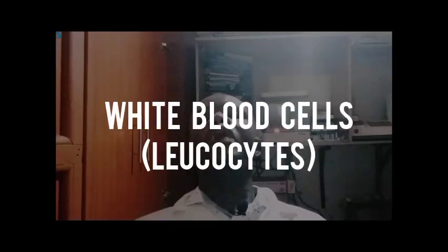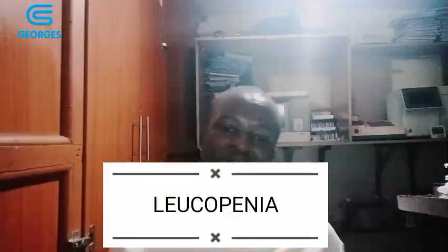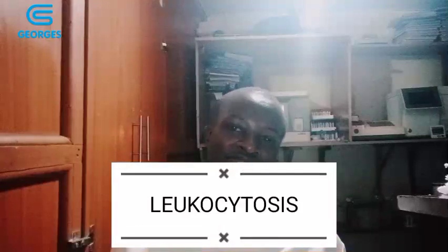Right now we want to do something on white blood cells. A decrease in the number of white blood cells is called leukopenia, while an increase is called leukocytosis. So when there is a low number of WBCs, we will say that is leukopenia. When it is increased, we will say that it is leukocytosis. The reference range is 3.5 to 10. WBCs, or white blood cells, or leukocytes, are majorly used in defense. They are used by the immune system to defend our body against diseases, and this is the bottom line of what we'll be discussing about WBCs.